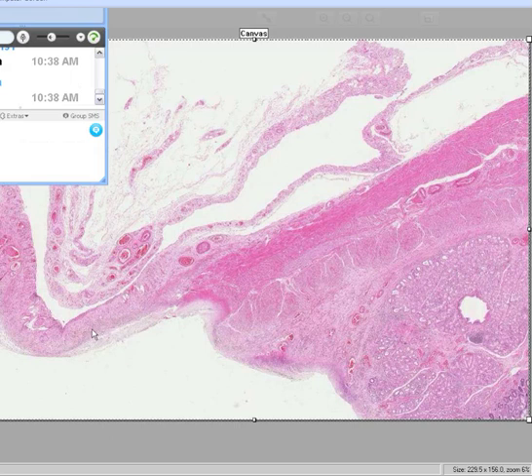But look, all of a sudden, you have an area here in which all it looks like there is is a little bit of connective tissue. You've lost your mucosa, you've lost your submucosa, you've lost your muscularis. So it's the duodenum, and you have an area that's paper thin. What would you like to diagnose? Of course it's an ulcer.